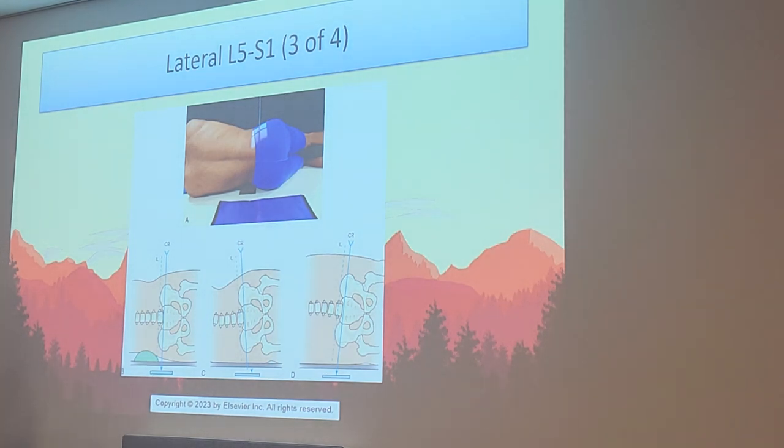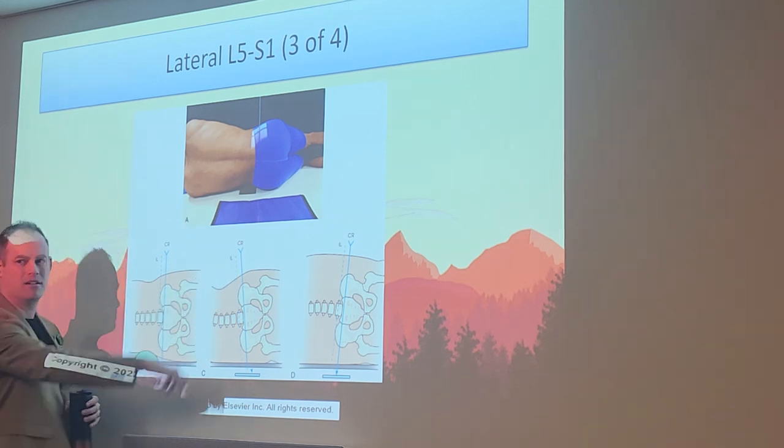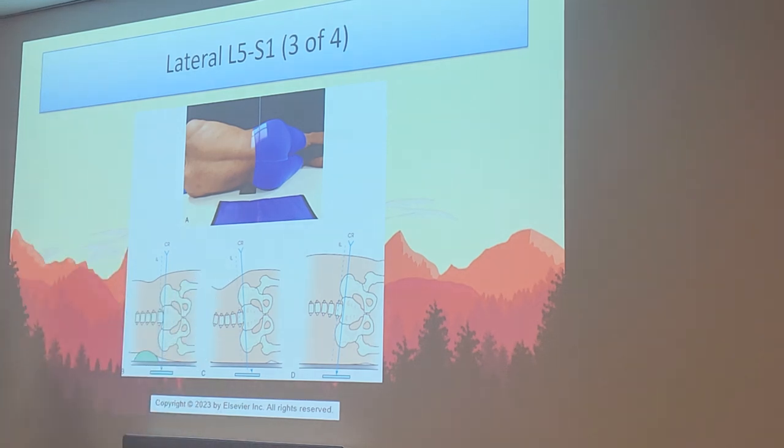Once again, what do I suggest you do? Personally, lay them on the table, put a 7-degree caudate angle every single time. You're going to nail it every single time. It's going to look great, especially if you do the little secret centering technique that I showed you. But just keep in mind, there are variances depending on the shape of the hips that you can slightly alter that tube angulation if you so choose. Basically, this is the way you're going to do it most of the time. This is what I suggest.